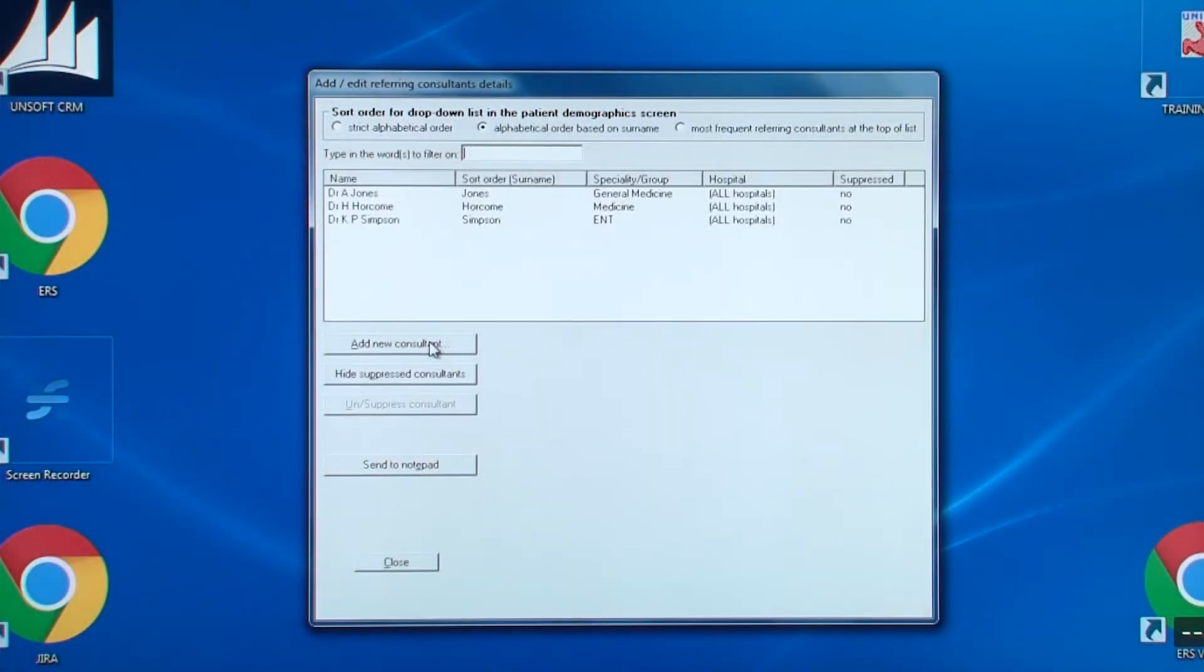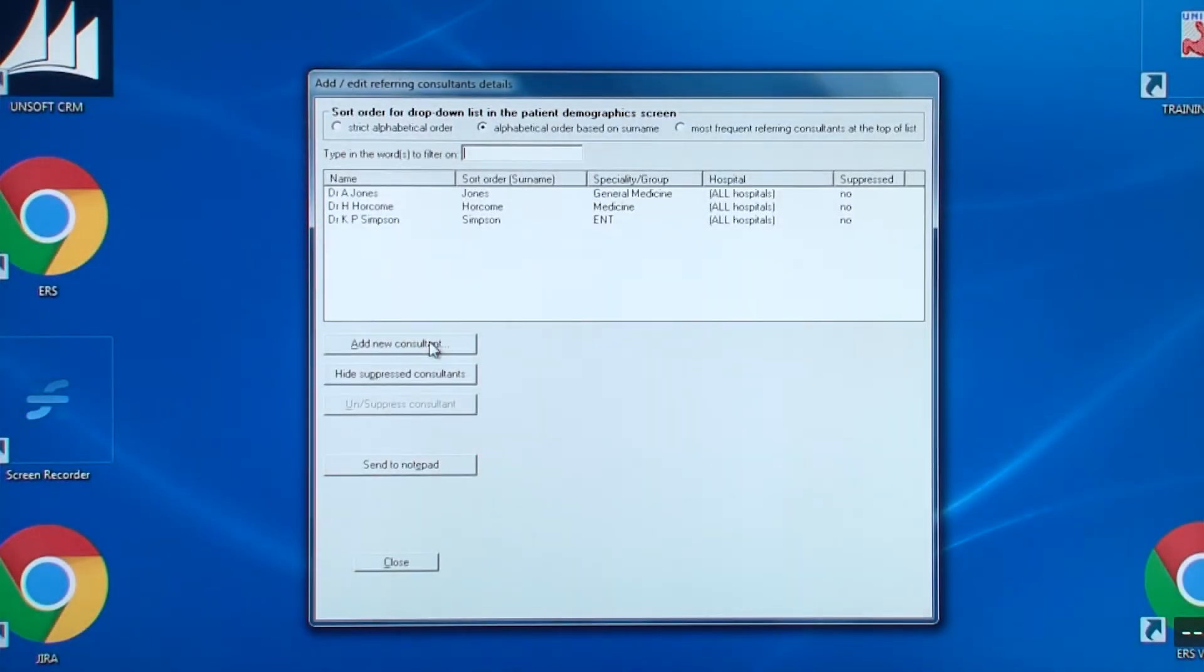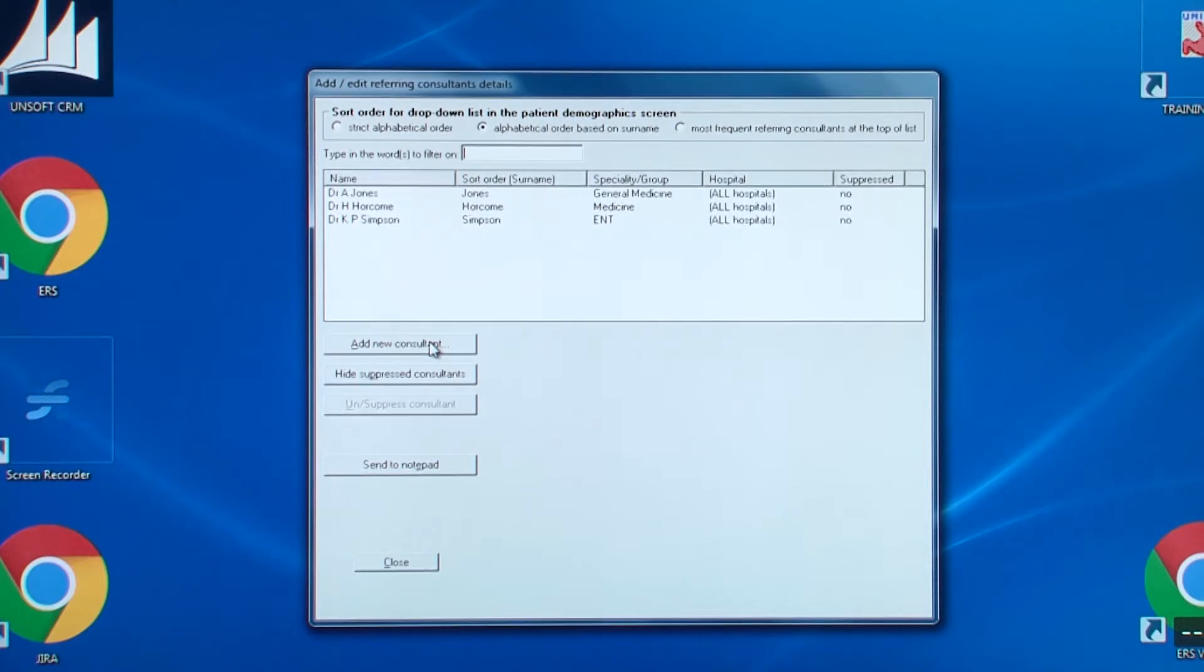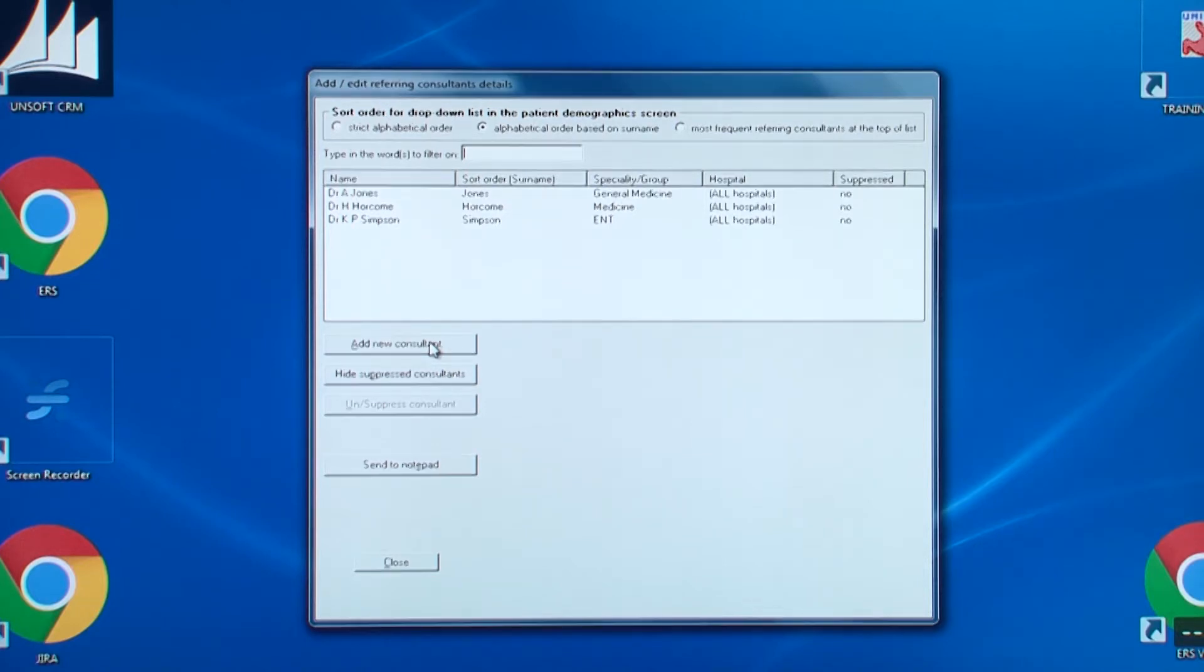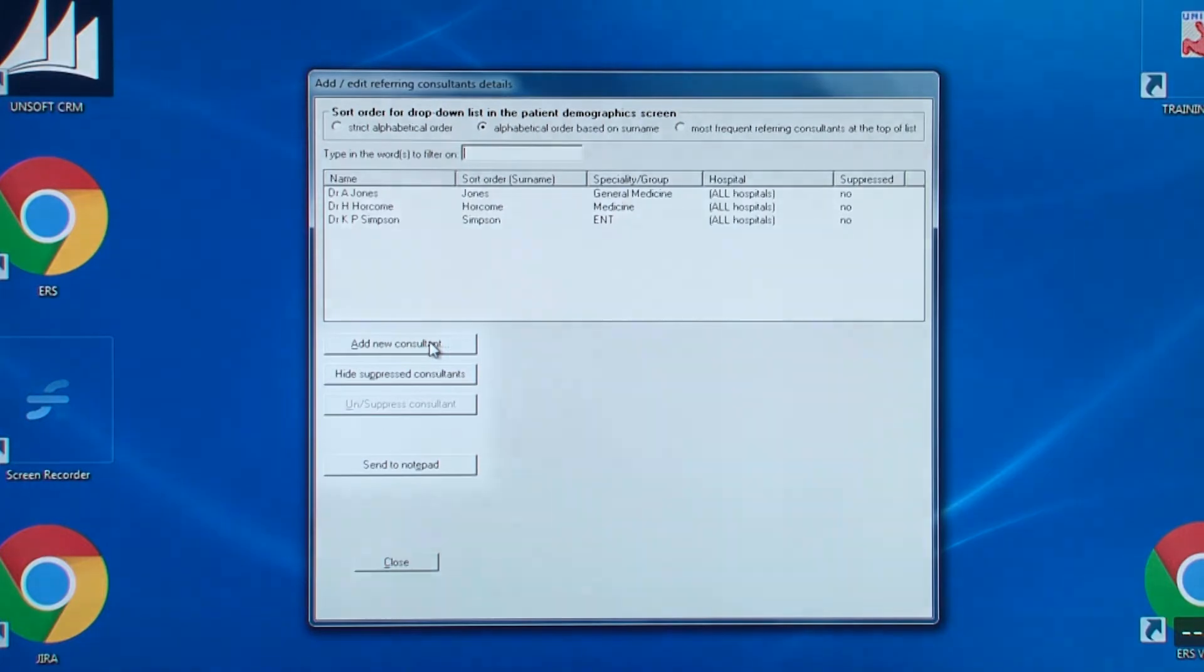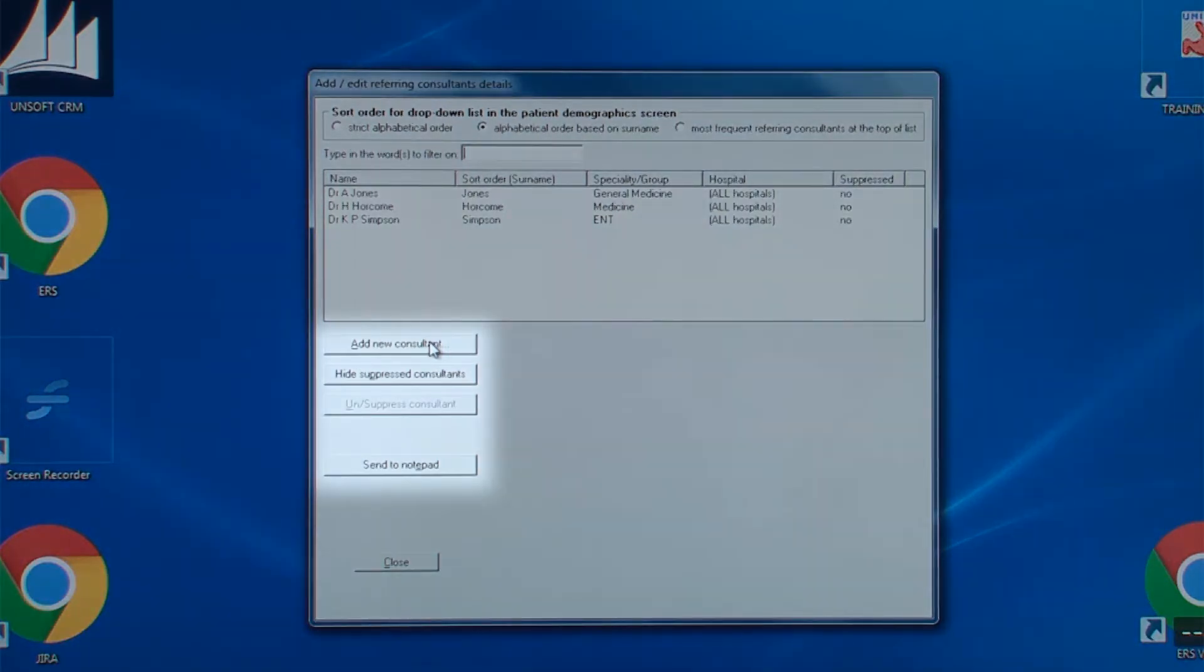Beneath that, you can filter the list of consultants to see whether one has already been added. These are the four main buttons on this screen. Let's look at adding a new consultant.